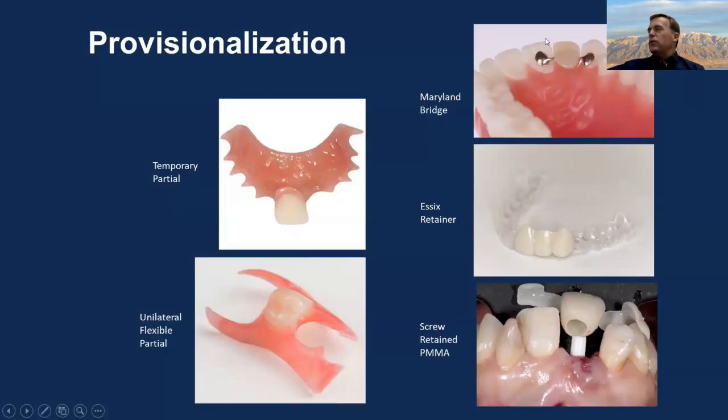You can also, this one has 2 wings as an aside. I was just hearing about a study the other day, a study about how 1-wing ones tend to be more stable. So you can certainly do a 1-winger here as well.